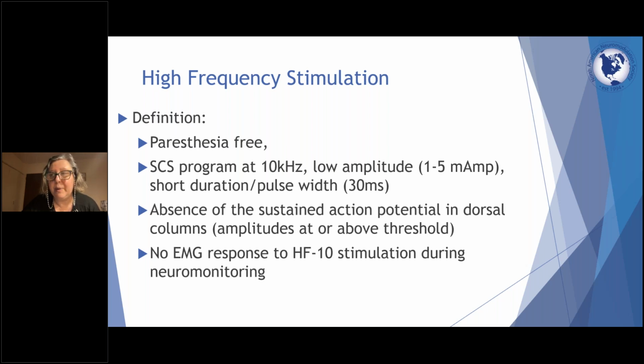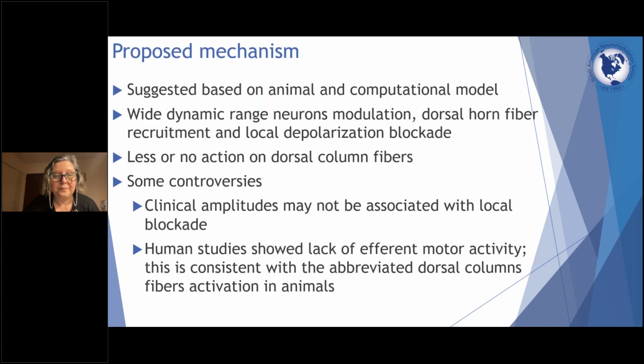What is characteristic about it, and very clear when you apply neuromonitoring in those patients, is that you have complete blackness in the neuromonitoring records. So there is no waveform on the neuromonitoring, which is in alignment with the absence of a sustained action potential in the dorsal columns.